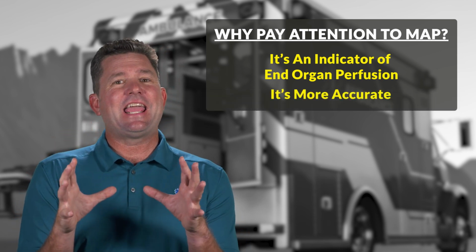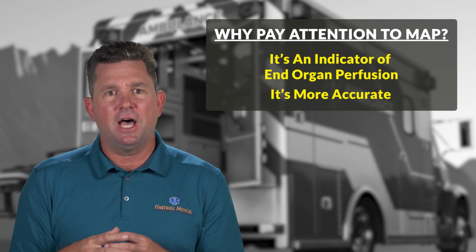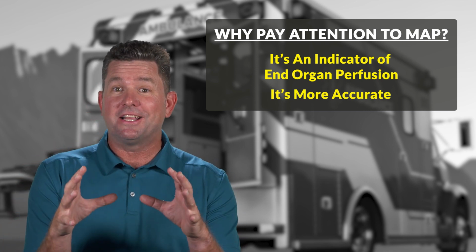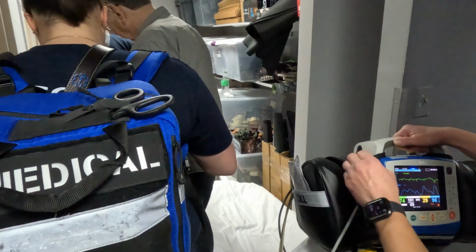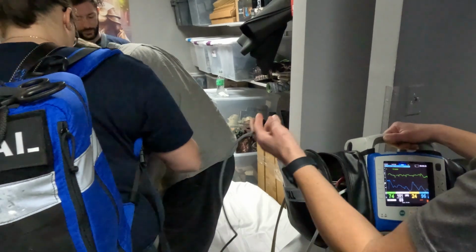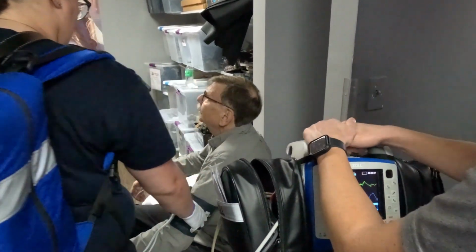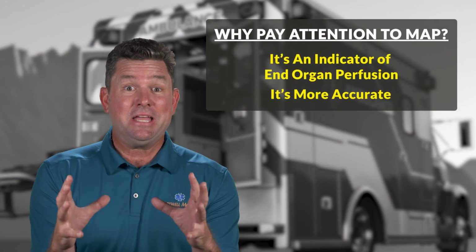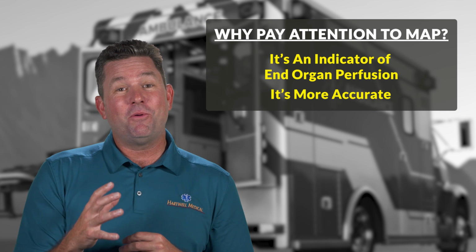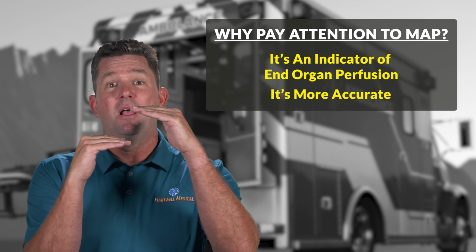It's also more accurate. And I know when I say that right now, there's some guy from Club Treat the Patient, Not the Monitor, who wants to warn us that auto cuffs are notoriously inaccurate. And that's true, especially for patients with abnormally high and abnormally low blood pressures. But you know what else is notoriously inaccurate? Manual blood pressures. And one of the ways we can overcome those inaccuracies is making sure that we're using both.